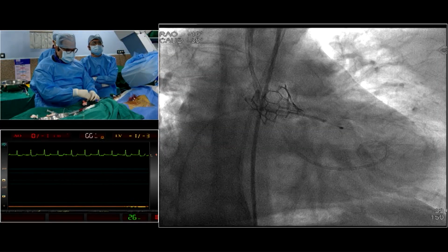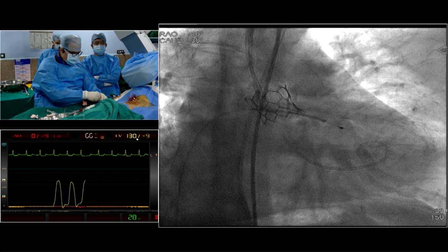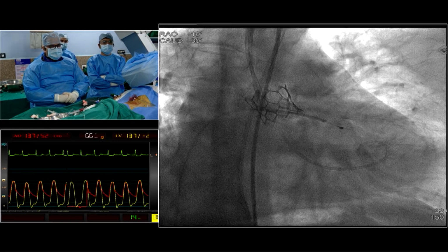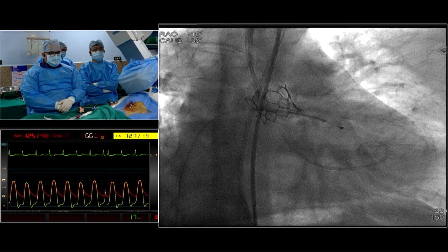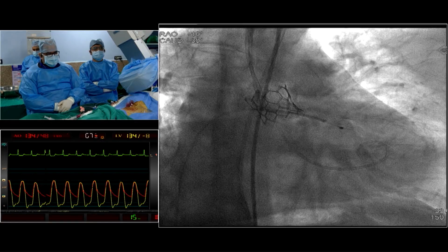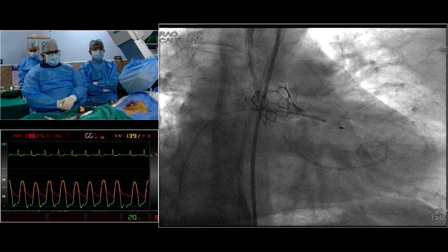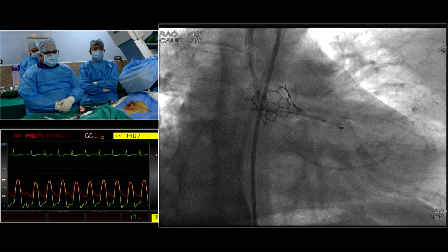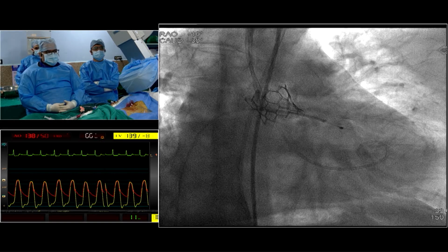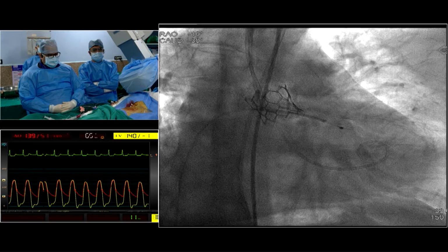Next, we are going to check the hemodynamics as the pigtail catheter is already inside the LV. We have flushed both the lines and we have zeroed both the lines. So this is the hemodynamics. You can see that there is no gradient, no systolic gradient. It's a complete overlap of the aortic as well as the LV curves in the systole, and there is very good diastolic separation. The LV EDP has not increased. All in all, it looks that there is no stenosis and there is definitely no significant aortic regurgitation. We also confirmed this on aortogram, which was taken and it didn't show any significant aortic regurgitation.